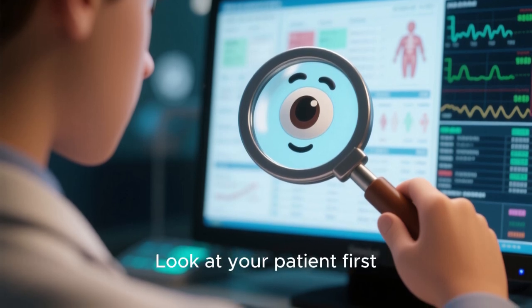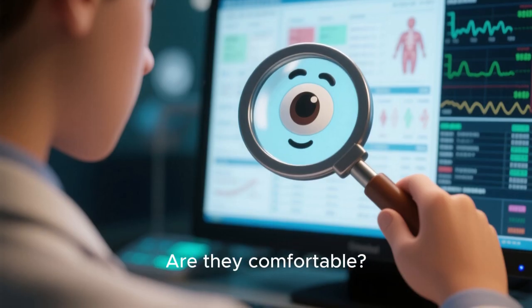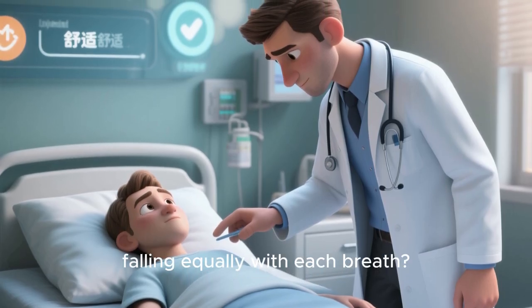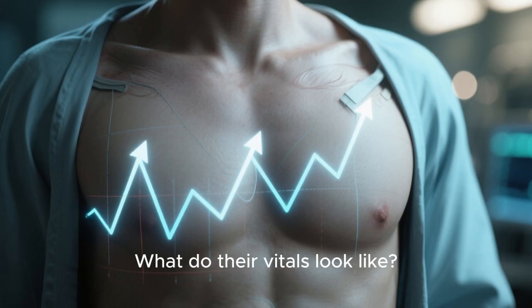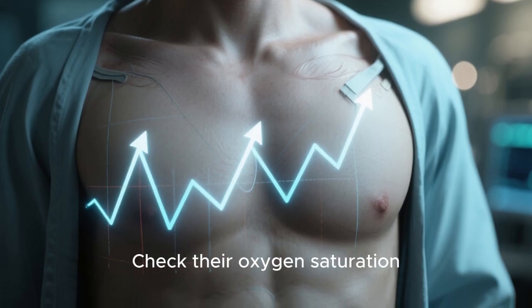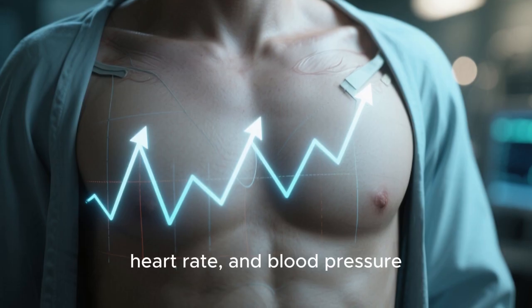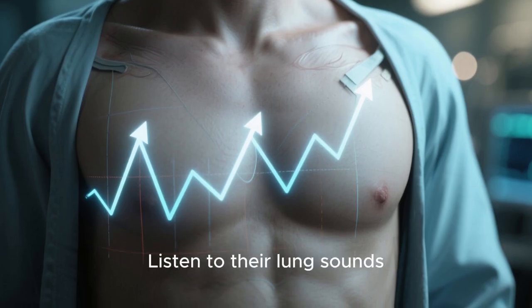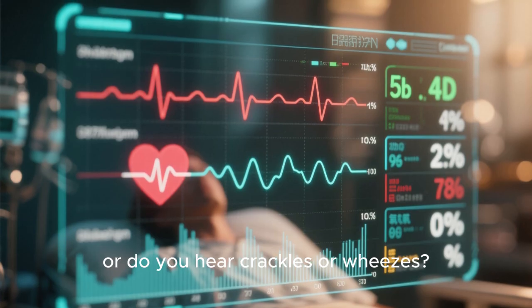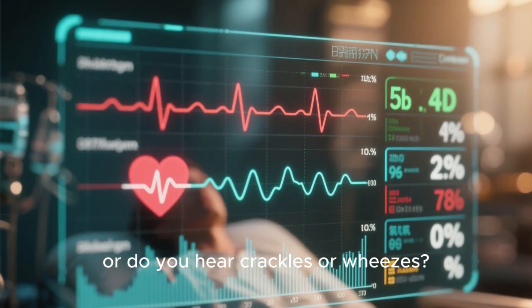Look at your patient first. Are they comfortable? Is their chest rising and falling equally with each breath? What do their vitals look like? Check their oxygen saturation, heart rate, and blood pressure. Listen to their lung sounds. Are they clear, or do you hear crackles or wheezes?